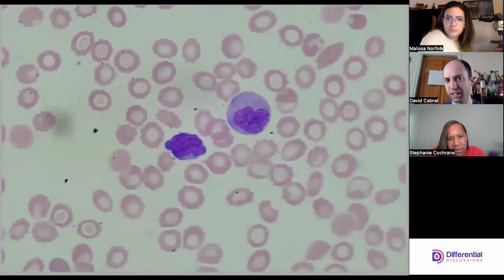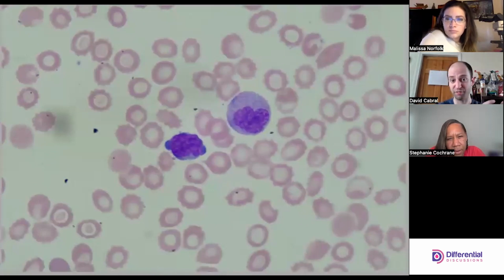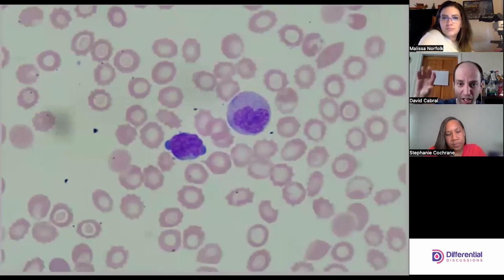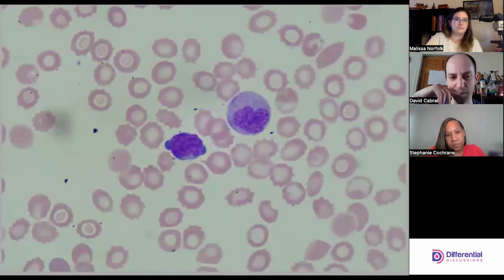Okay, so that looks like a Döhle body. So a reactive lymph, monocyte, but the staining in the cytoplasm is bugging me. But that lymph is angry. That basophilia for me is a lot.